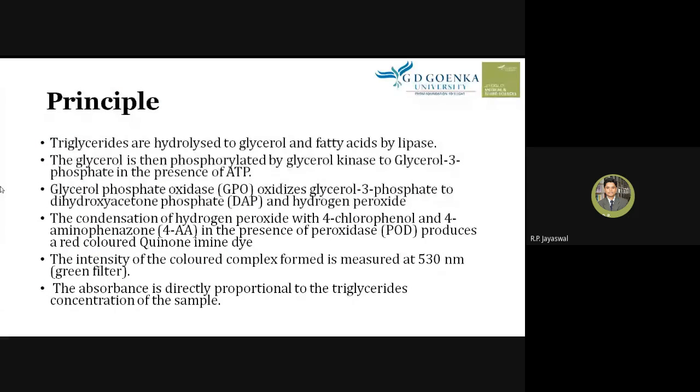The intensity of the color complex is measured at 530 nanometers, and the absorbance is directly proportional to the triglyceride concentration of the sample. We understand that if there is a high absorbance, there will be a high level of triglyceride in the given sample.